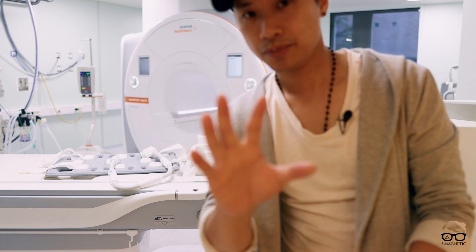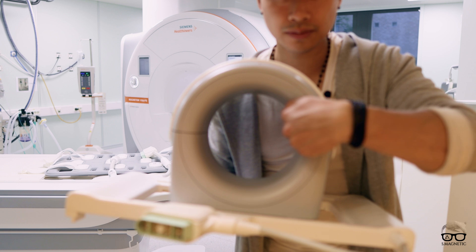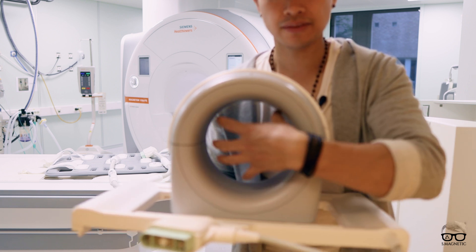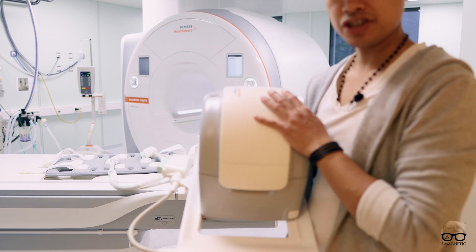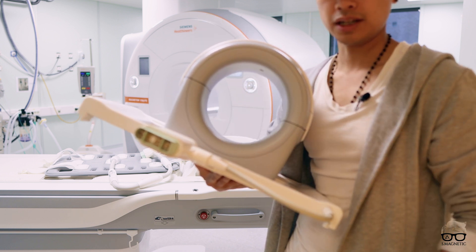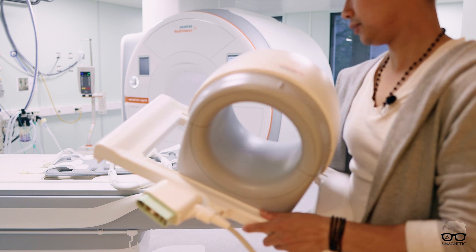One last coil which just recently came in is the 18-channel knee coil. If you look into it, where the knee goes — it's very round, not oval or anything like that. It takes place for the knee, it's big so it will fit most patients. Hopefully it's 18 channels. Another thing I noticed is that instead of having the cable going all the way around, you have the opportunity to lock it like that and transport it without destroying the cable. Very awesome design.